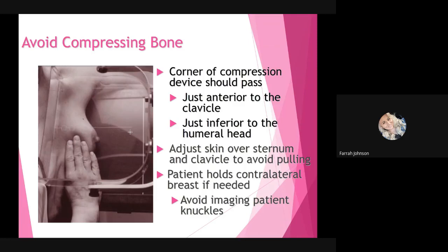And the patient is going to hold the contralateral breast if needed, but you want to avoid imaging the patient's knuckles. So as the patient is holding this breast out of the way, you want to make sure that their knuckles are not going to be anywhere over this little paddle right here.